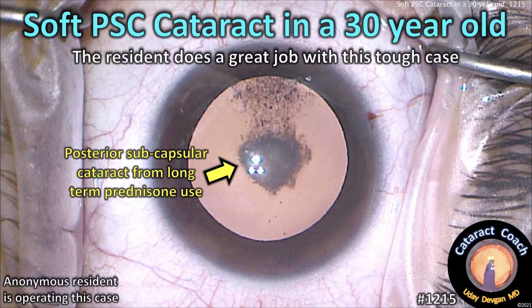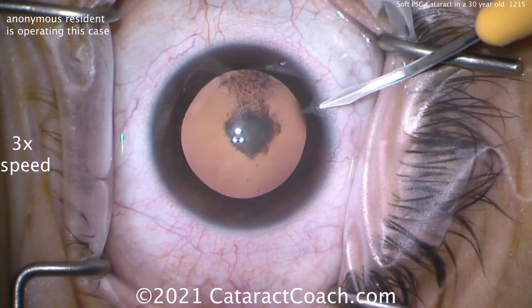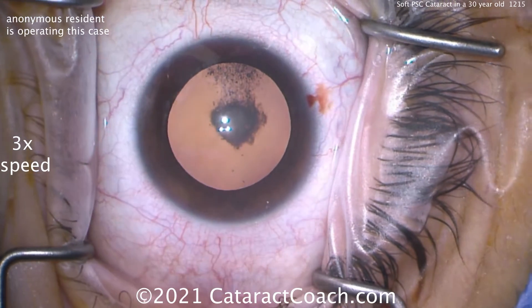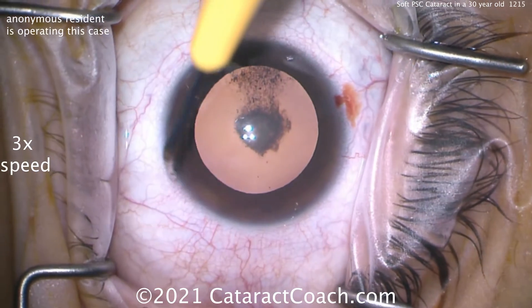CataractCoach.com. Soft PSC cataract in a 30-year-old. This young resident does a great job with this tough case. This is a patient who's 30 years old and has been using corticosteroids for some systemic medical problems and has developed this cataract.